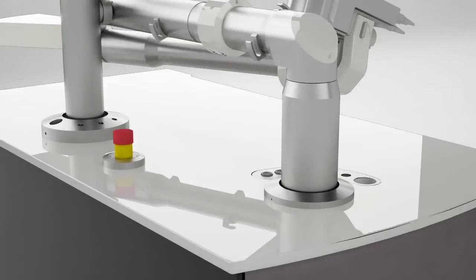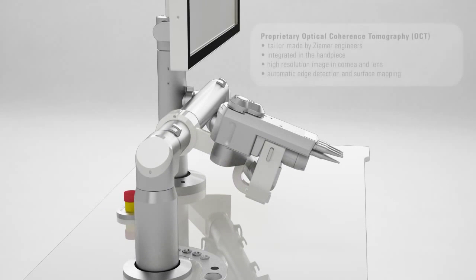With over 2 million refractive procedures performed with the Femto LDV systems, the Z8 is based on a proven technology, different from other systems in the market.